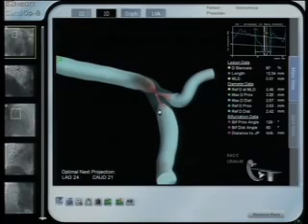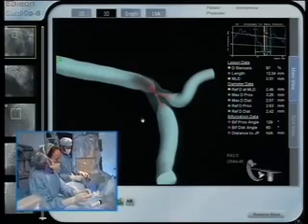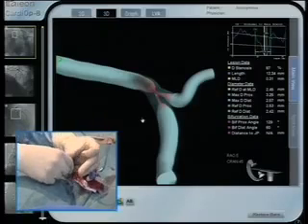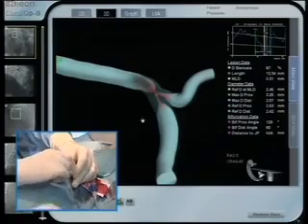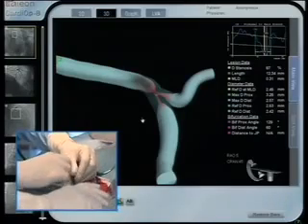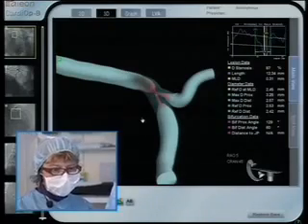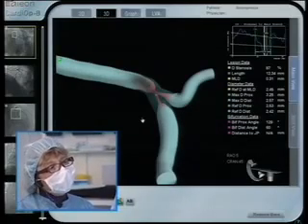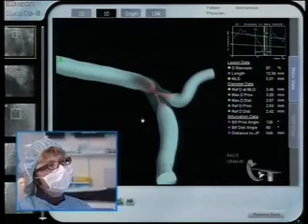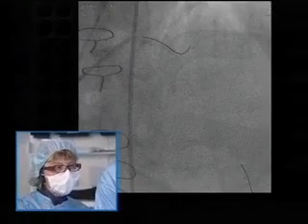So you know that it's nearly always our strategy. But this time, because of the size and because of the shortness of the lesion, it will be one stent with a provisional strategy, if necessary. But we will do our best and try to convince you that with only one stent you can cover the ostium of a diagonal without needing a second stent, avoiding too much metal and maybe the risk of... Go back live, please. Go back live. Thank you.